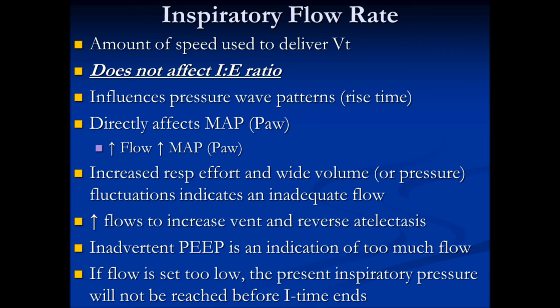Inadvertent PEEP is an indication that you have too much flow. That's a very important thing to know about neonates, because if you notice that their PEEP levels are higher than what you have set, it's probably because you have too much flow set on the ventilator. If flow is set too low, though, the preset inspiratory pressure will not be reached before I time ends.